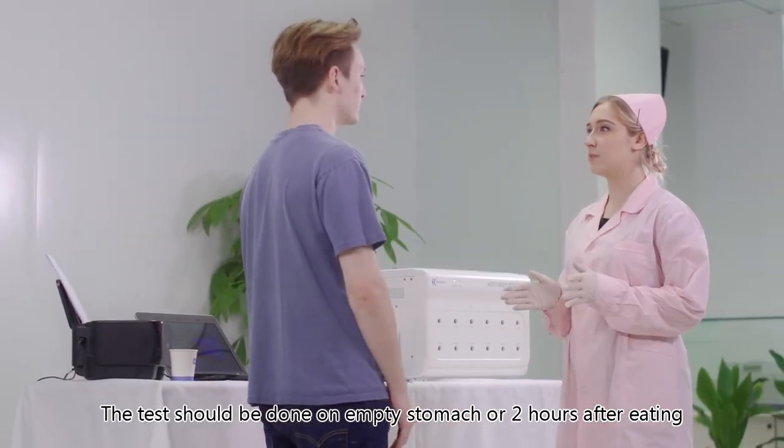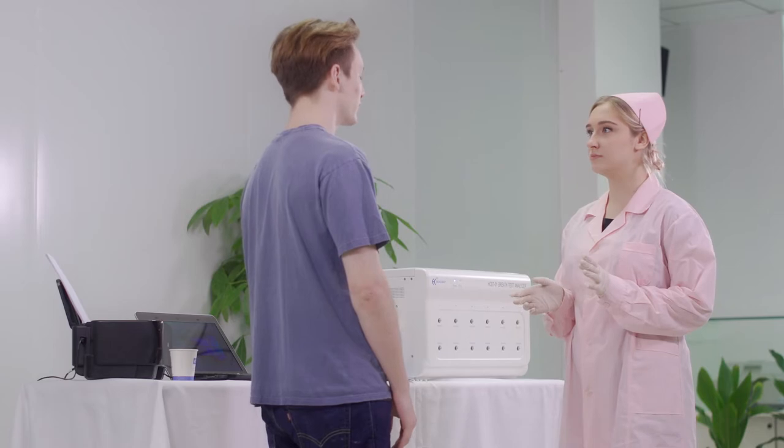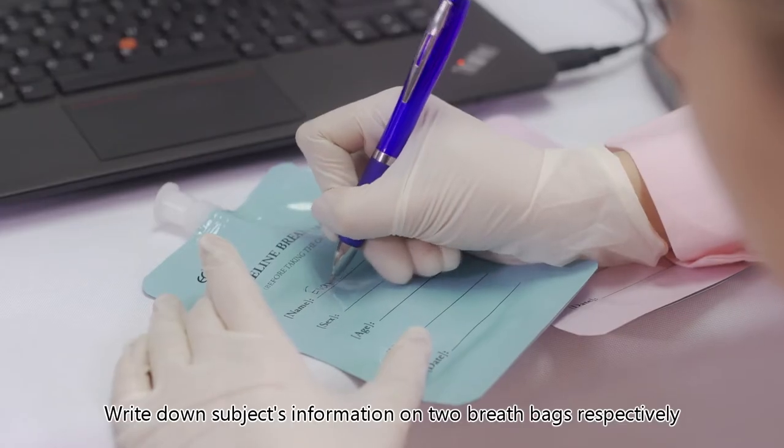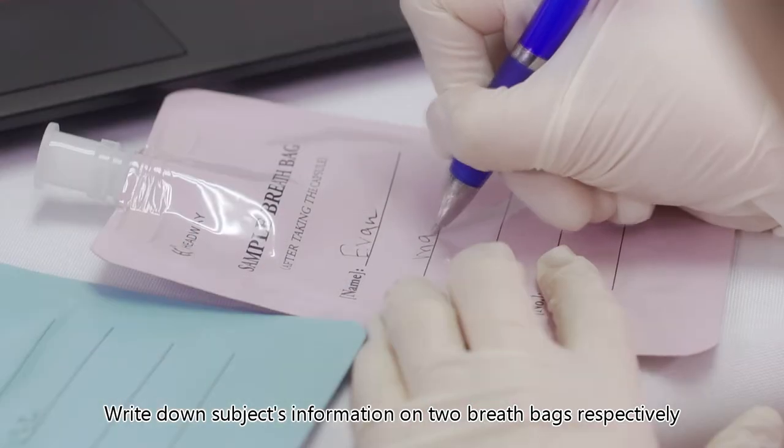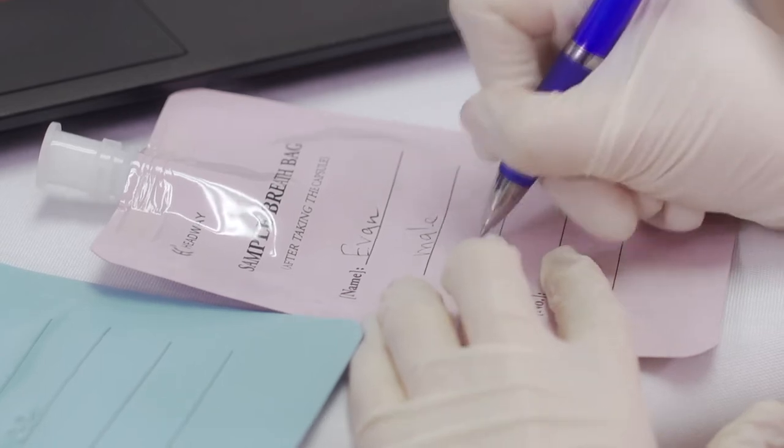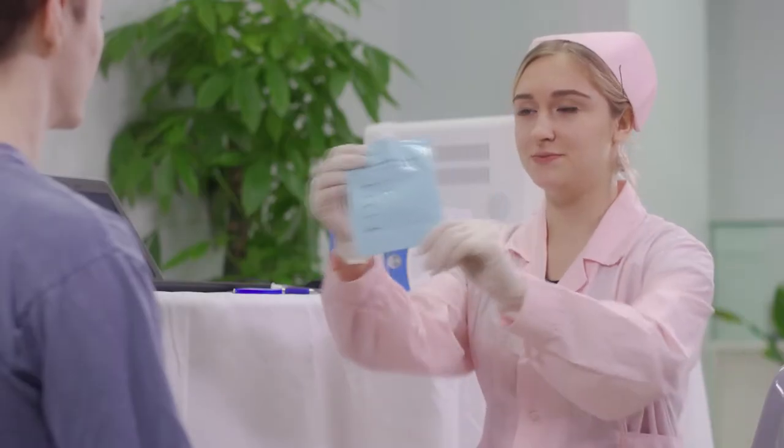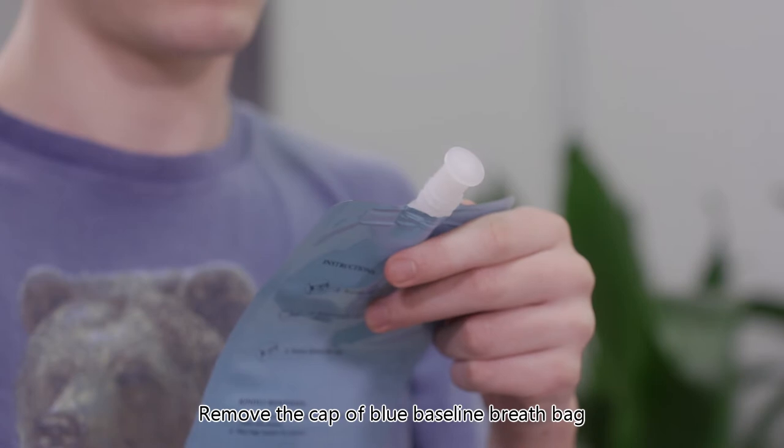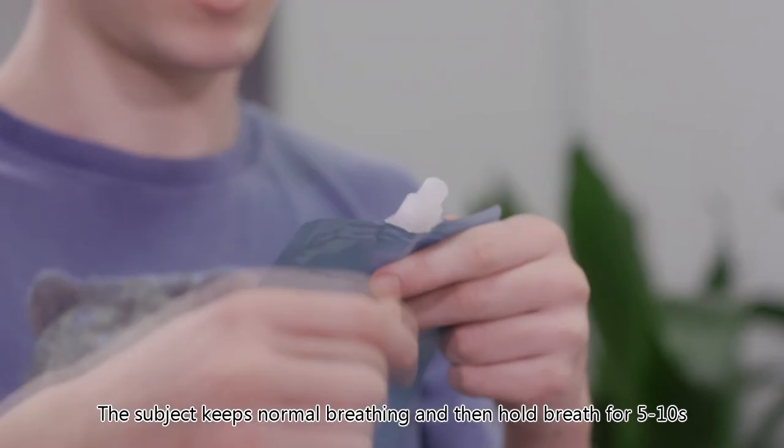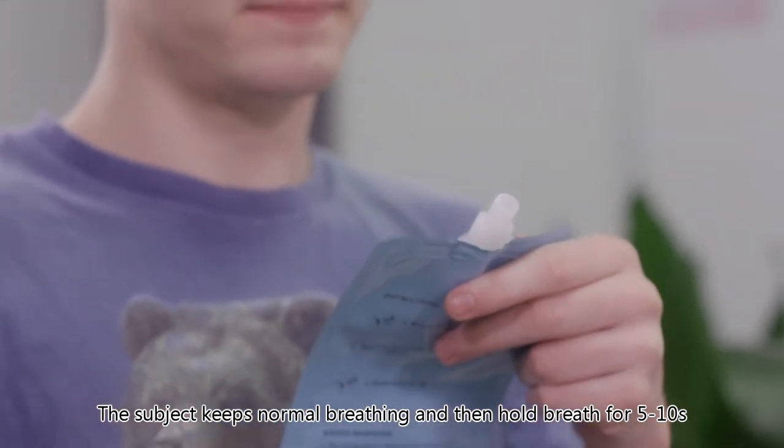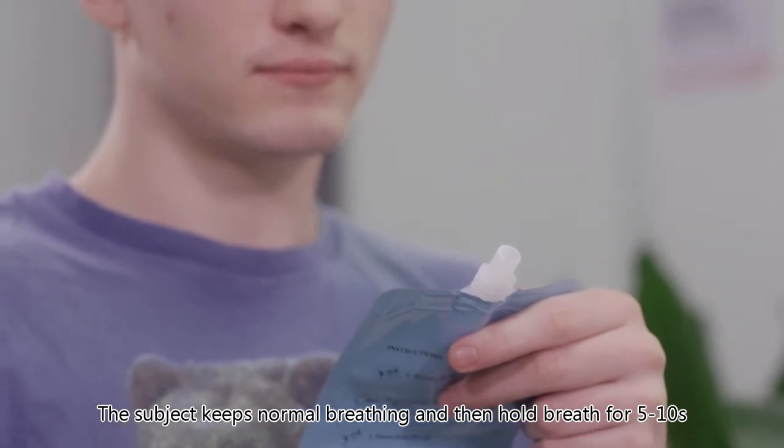Write down subject's information on two breath bags respectively. Remove the cap of blue baseline breath bag. The subject keeps normal breathing and then holds breath for 5 to 10 seconds.